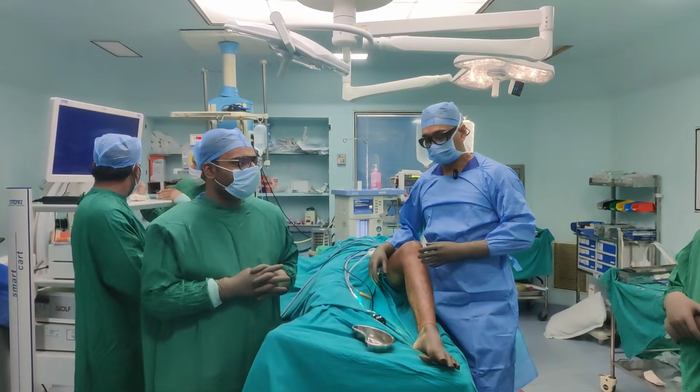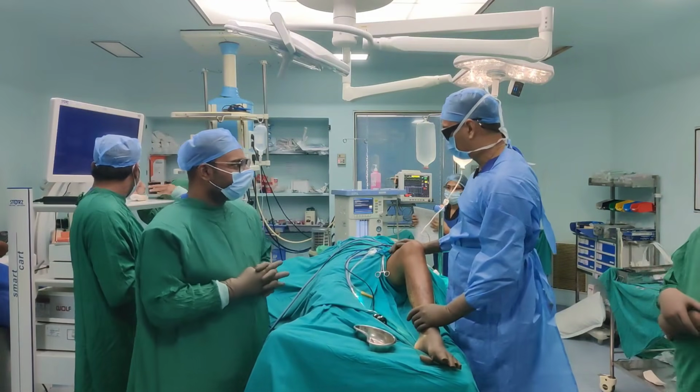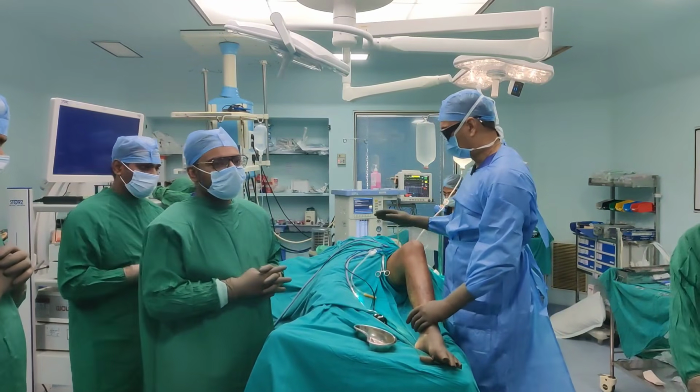So today my goal is to take you in a step-by-step fashion as to how to do a successful arthroscopic PCL reconstruction using hamstring autograft. So this is our theater position. We are all set up. The patient is supine. We do use the tourniquet.